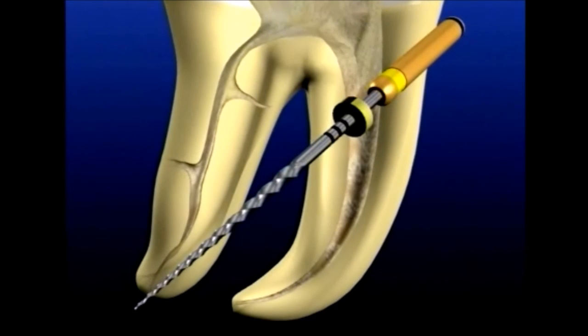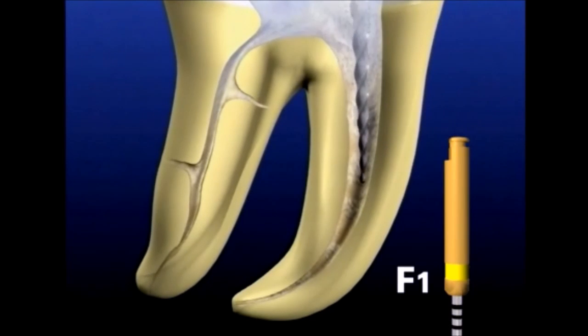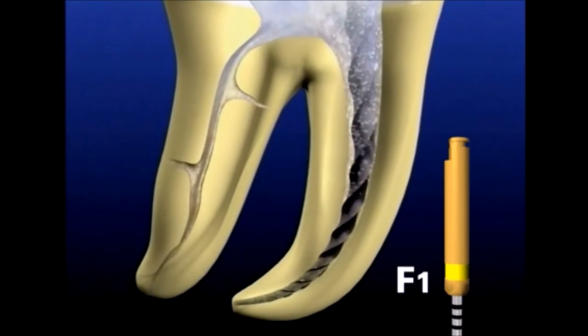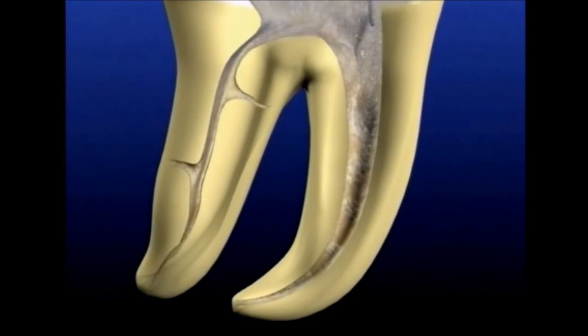Our first finishing instrument is Finisher 1. It's a 20 at D0 and has a 7% taper. This instrument will easily and readily follow the pathway of the previous shapers, and just shy of length, the instrument is immediately withdrawn as the final shape has been carved.